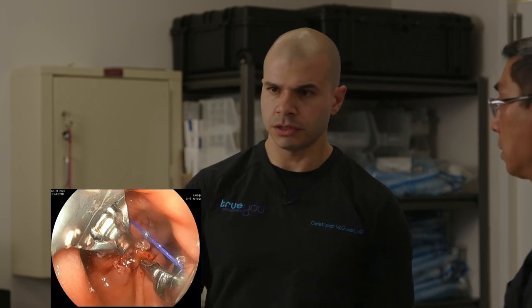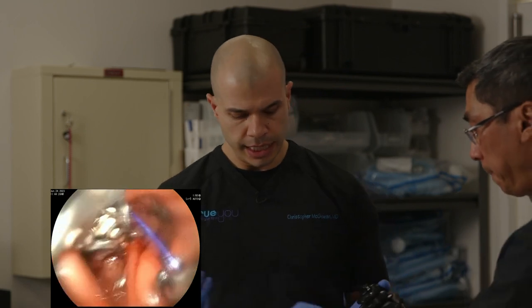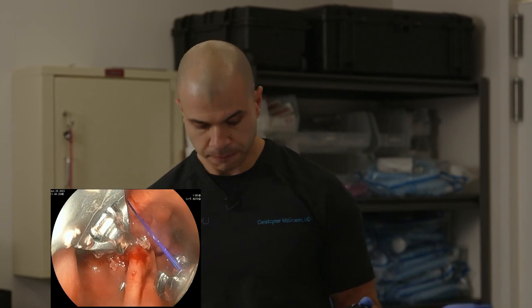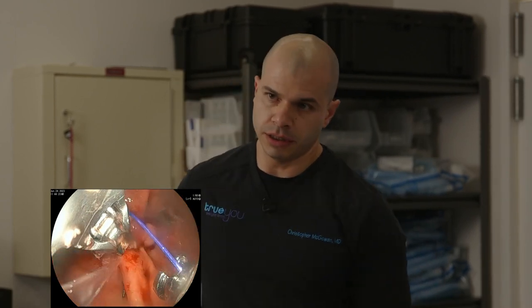So I think we'll cinch right there. And then we will be finished. Normally this procedure is about 30 minutes or less in duration, depending on the patient and their anatomy.